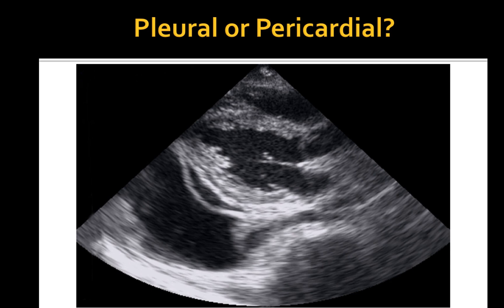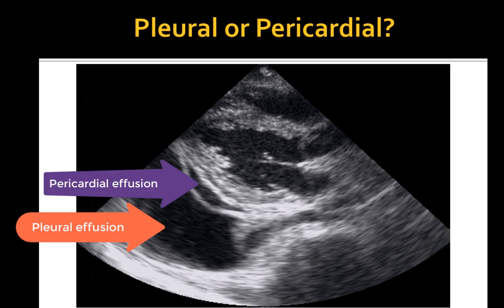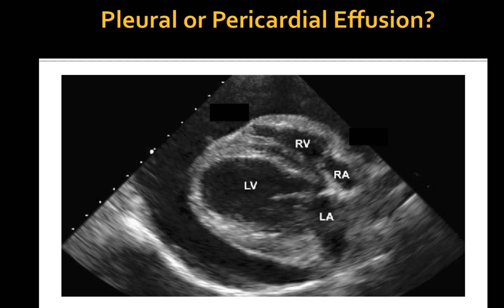This patient has both pleural and pericardial effusions; however, pleural effusion predominates and only a small amount of pericardial effusion is present. To differentiate between the two, it is important to identify the bright echogenic pericardial sac, which usually has a circular shape surrounding the heart.